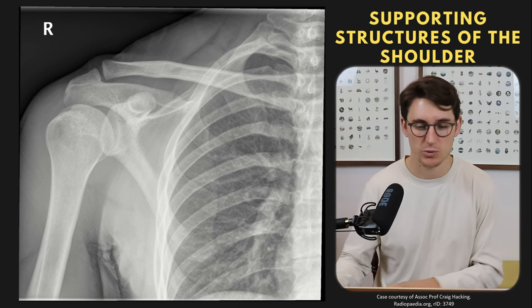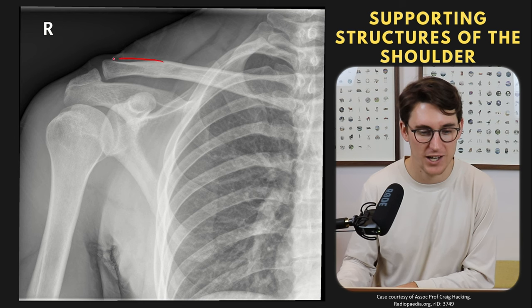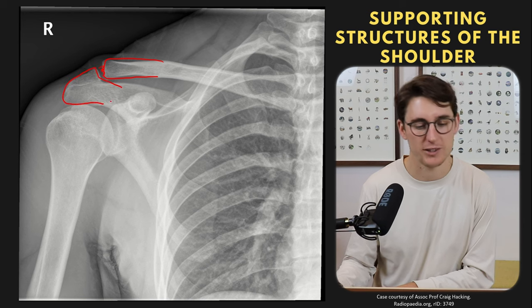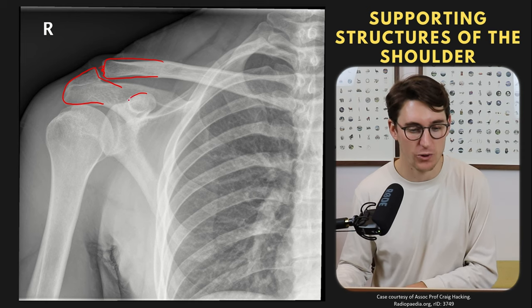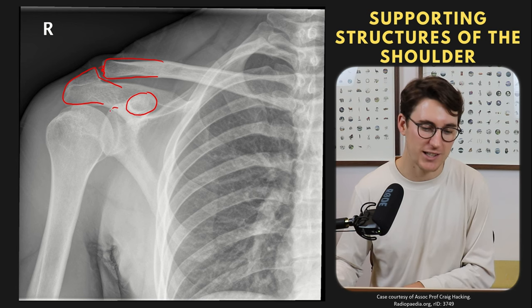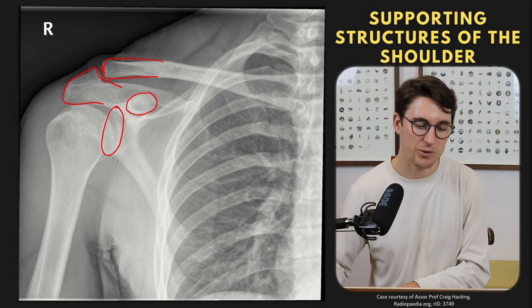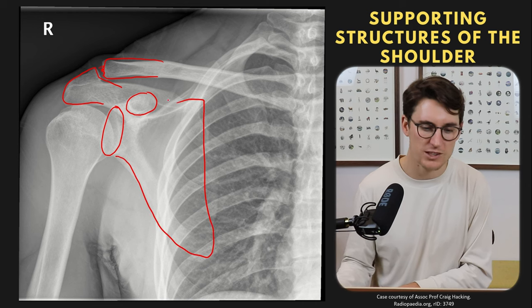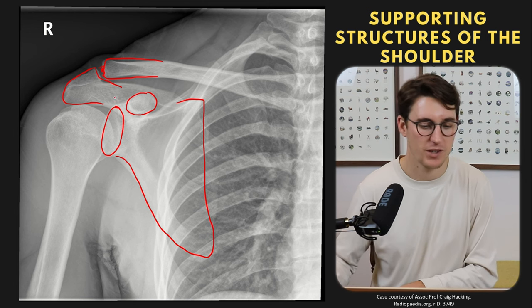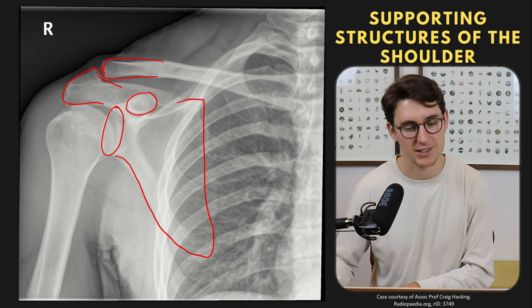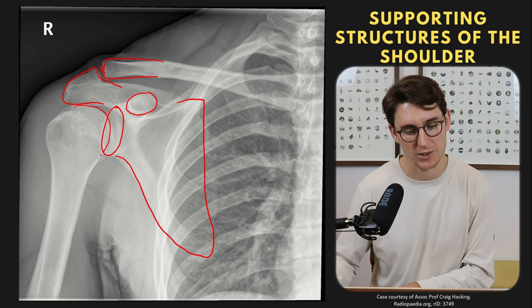Starting with the bones: the clavicle comes across and attaches by the AC joint to the acromion of our scapula. Anteriorly we have our coracoid process — a really important landmark on MRI scans. We can see the shallow glenoid fossa, and the scapula posteriorly with its spine coming across to the acromion. Our humerus has a humeral head that articulates with this glenoid fossa — this is our glenohumeral joint.